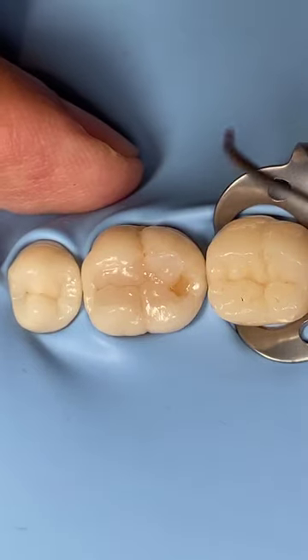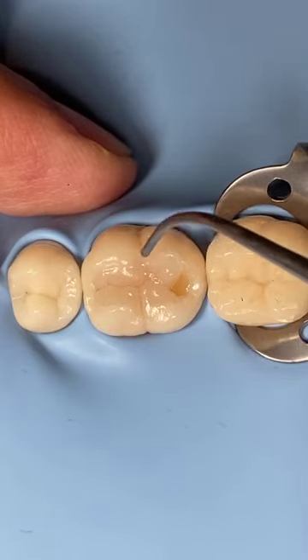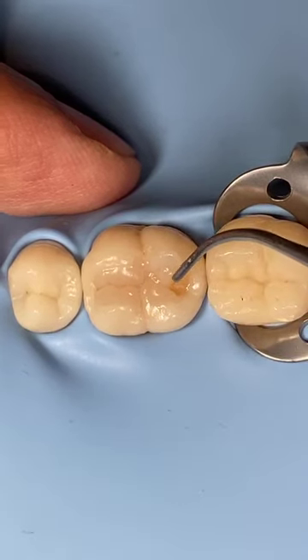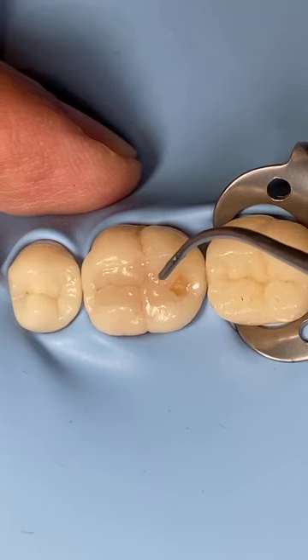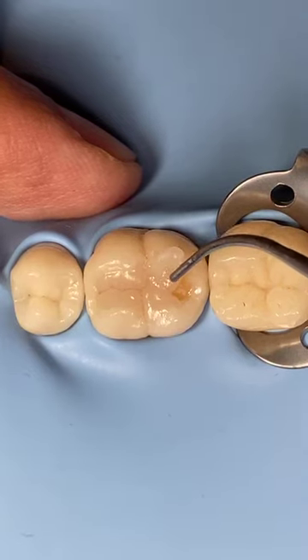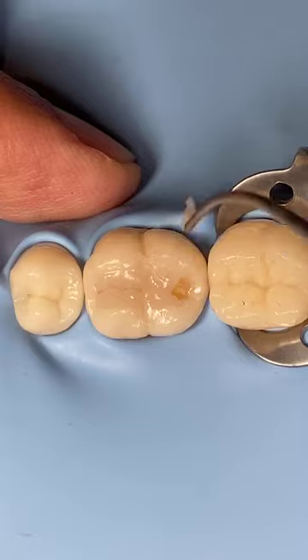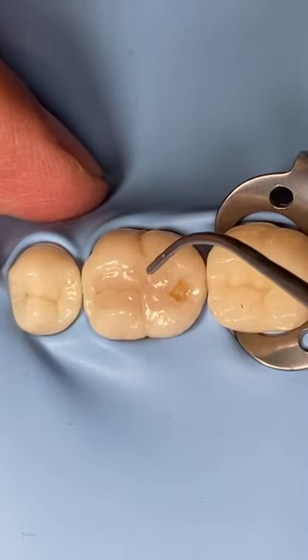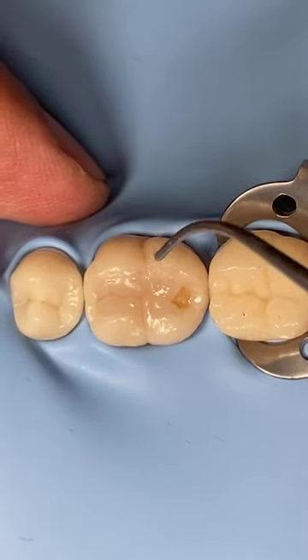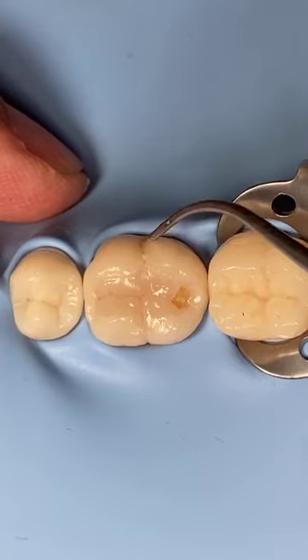Remember the first step. I will repeat it again, maybe 100 times, so you will not forget what I told you. The first step is you take a big amount of composite and then place it on the cavity, and then reduce and press, following the cusps' inclination, and then you cut back or reduce with the guide of the cusps. Use the cusp as your guidance to remove the excess. Don't worry about the composite joint here. Just relax.